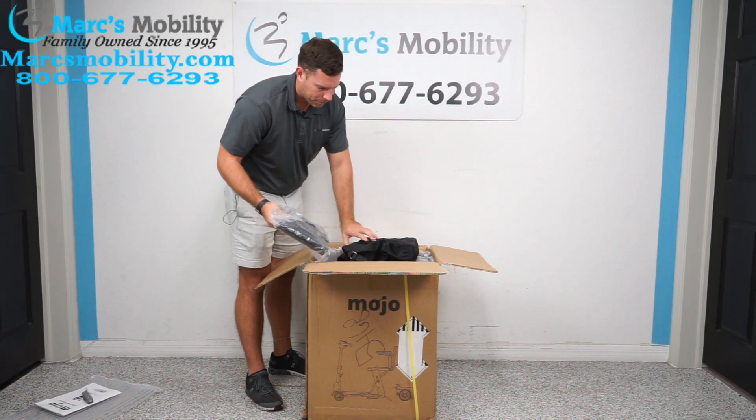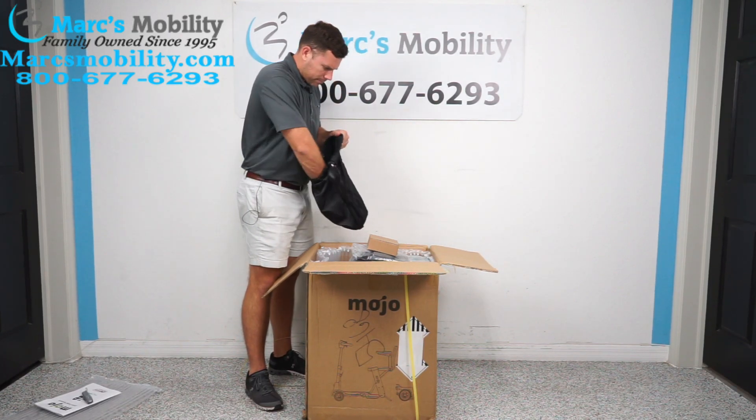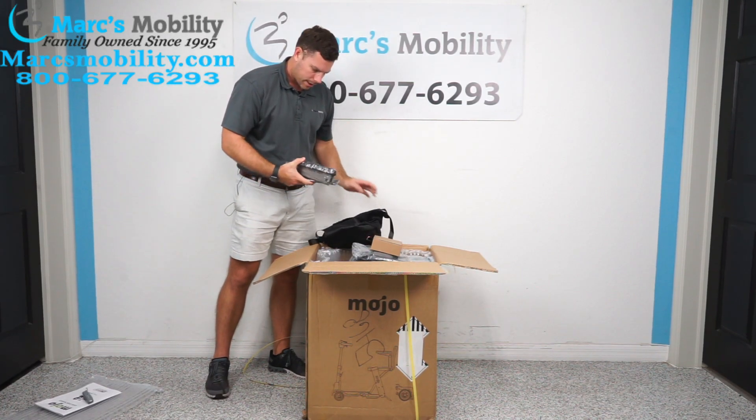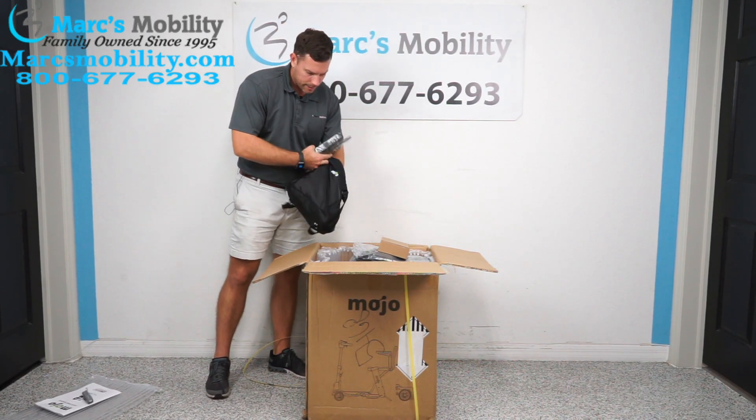Inside your bag, you've got your front folding basket and your charger. This also looks like your arms for the unit. All of this is going to come in this nice carry bag that they give you.